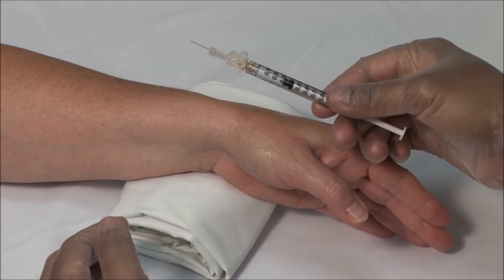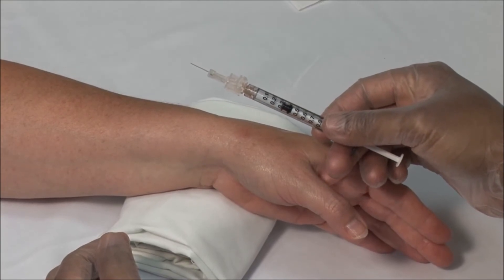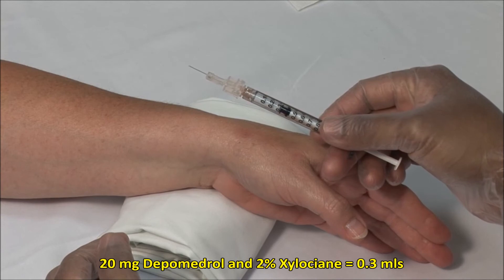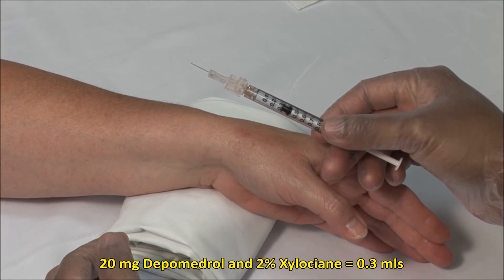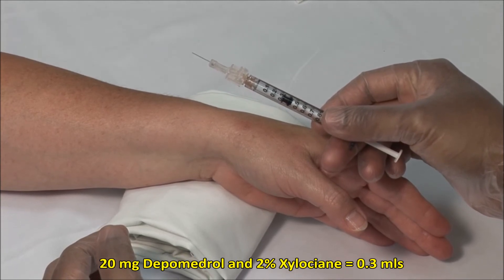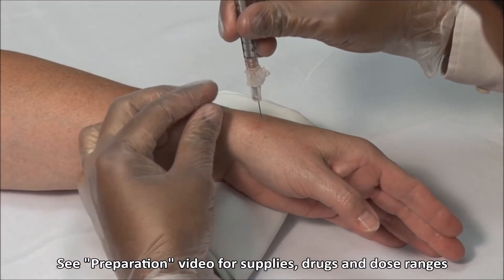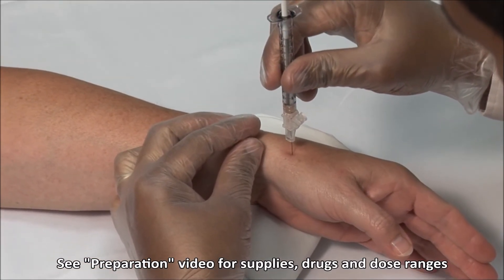Here I have a 1 ml syringe with a 25 gauge 5/8 inch needle and a mixture of 20 mg of depo-Medrol with 2% xylocaine, mixed to a volume of 0.3 ml. With the syringe held vertically, advance the needle into the joint.